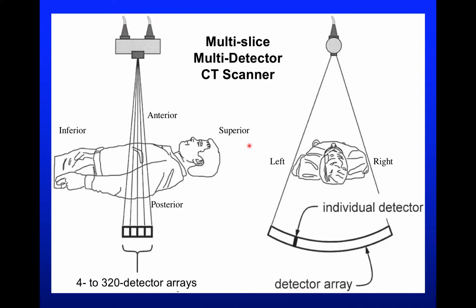So when you're looking at data in 3D, usually what's labeled in the corners or the sides of the image are these coordinates, right? Usually just the first letter.